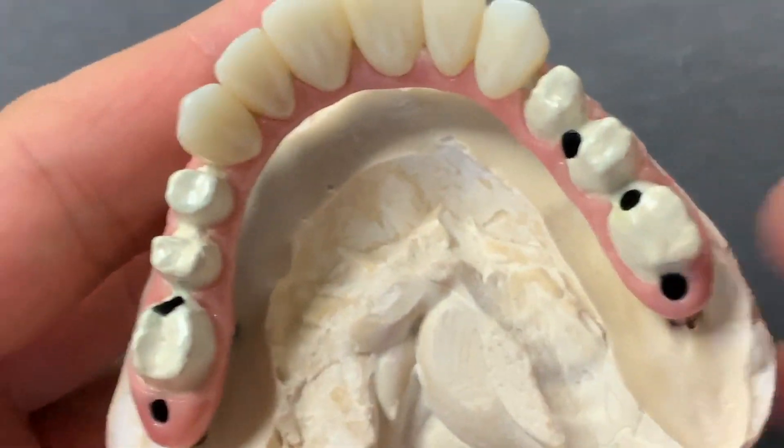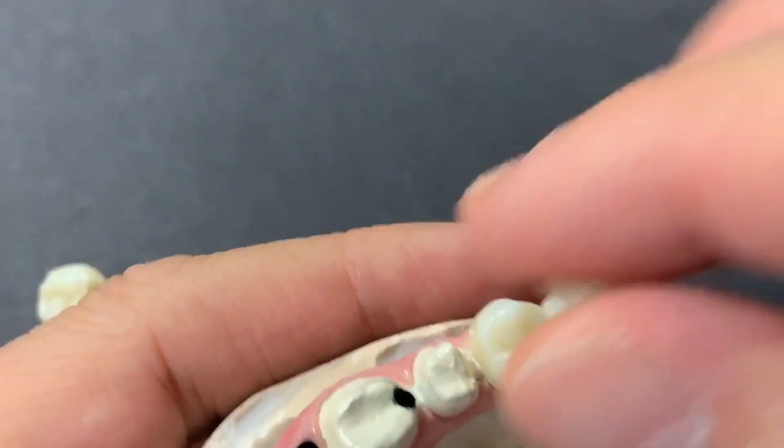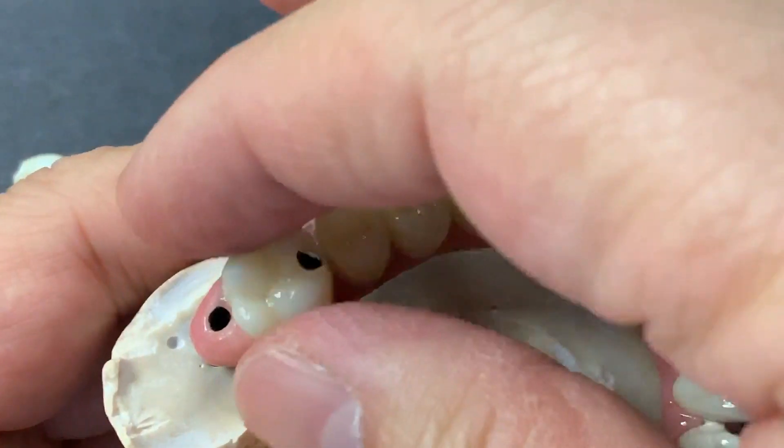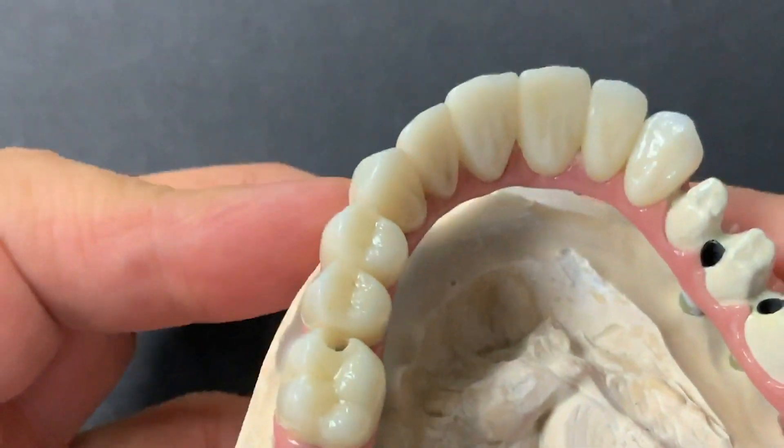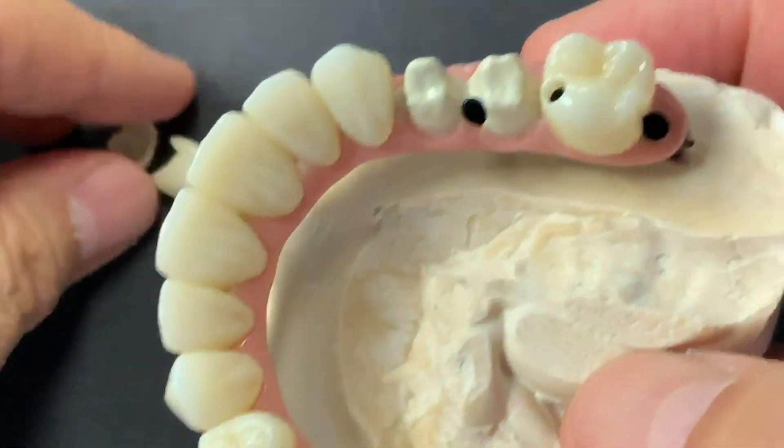And here are the two spots — one, two, and then three. So we make it a little bit thicker here. And here is the final. This is a piece of art.